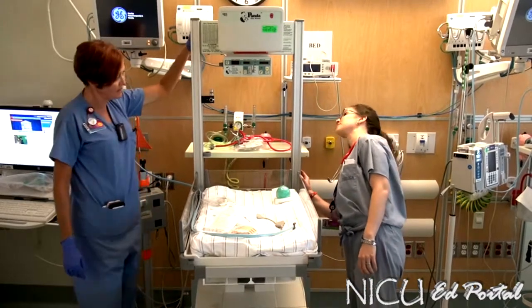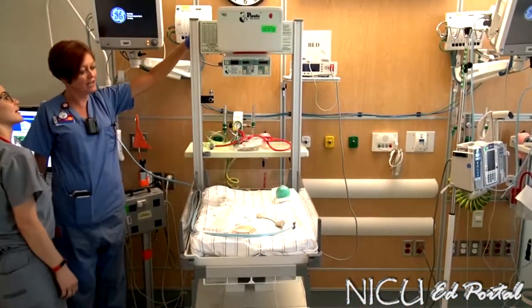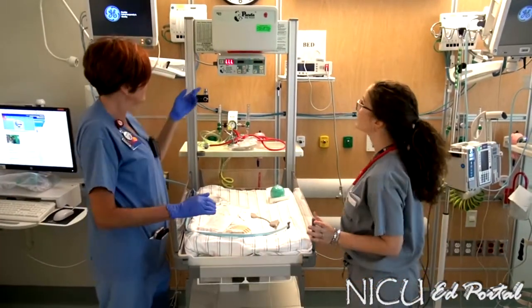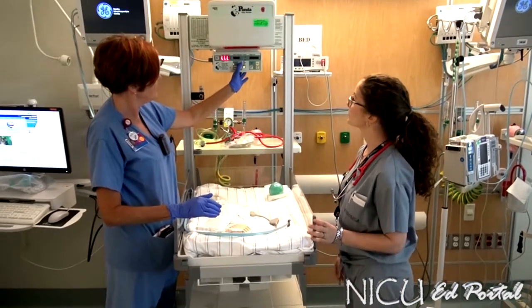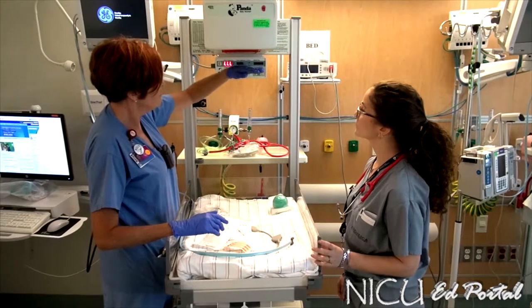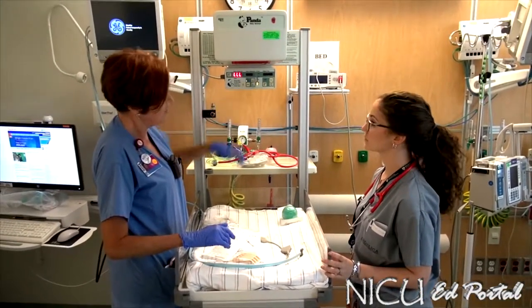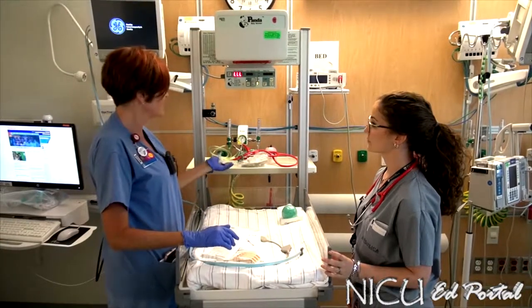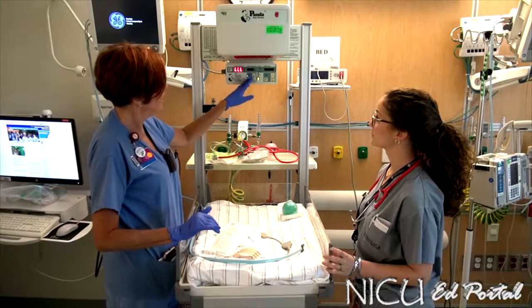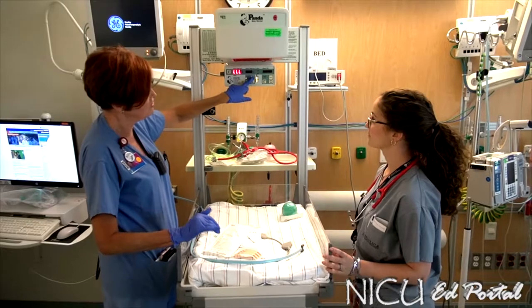When you activate it — it's right up here in the corner — once it's activated, it'll go into a mode where radiant heat is coming from here. There also is a servo mode, which is a facility we use primarily when the baby comes up to the NICU. But for now we're just going to use manual mode and you will have it at 100%.